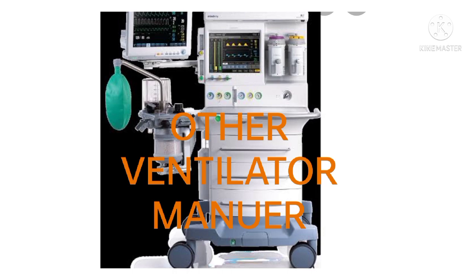Extracorporeal membrane oxygenation, ECMO, is an alternative form of pulmonary support for the patient with severe respiratory failure. It is used more frequently in the pediatric and neonatal populations but is increasingly used in adults.